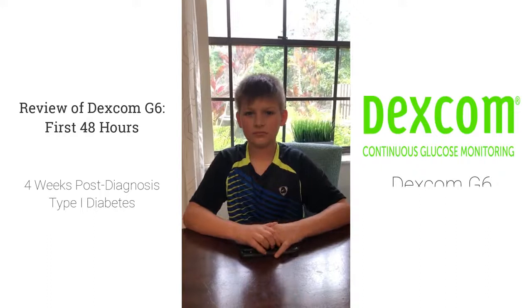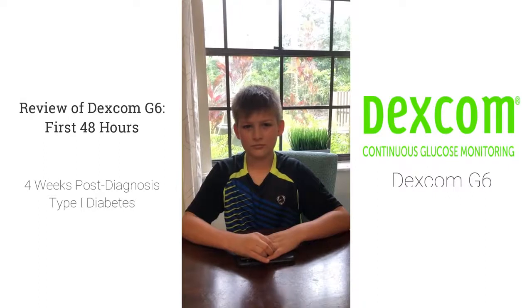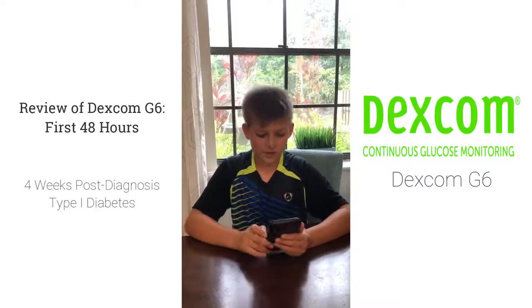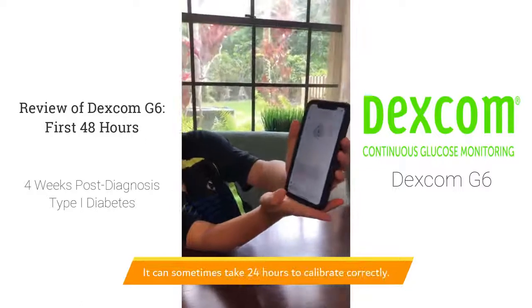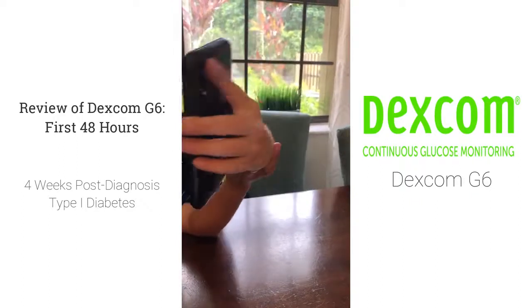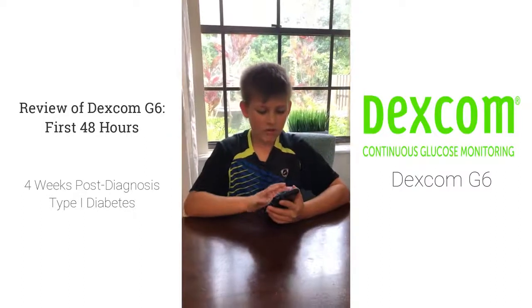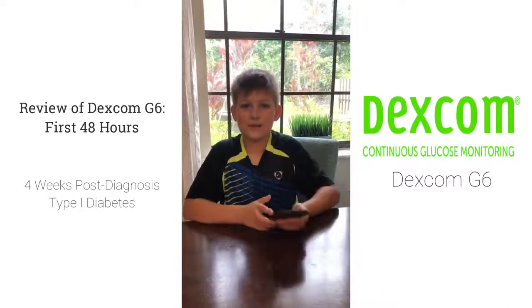But we had a few issues the first night, right? It kept going off all the time saying you were super low, but we took your blood manually and it was okay. So we fixed that because there are these settings down here — if we press that, it says calibration. And if we press this, then we would put in what my blood sugar is, and it would get a better accurate number compared to the number it's showing and what I got.